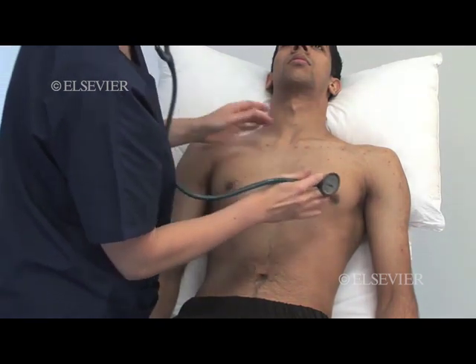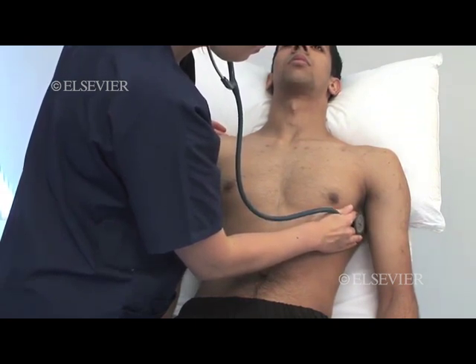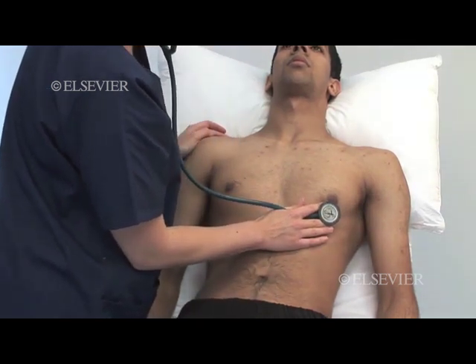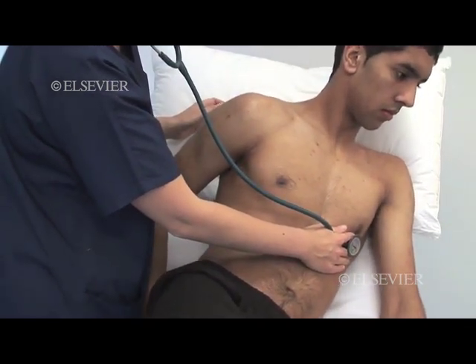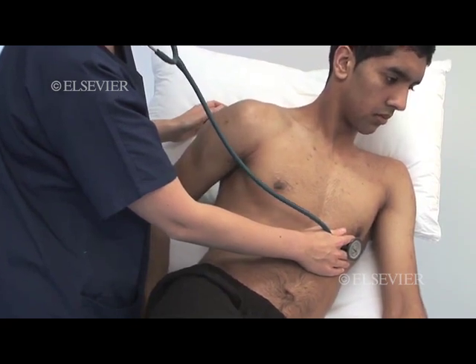Next, listen specifically for mitral stenosis with the bell at the apex. Please could you roll onto your left-hand side? This is accentuated in the left lateral position. It's a mid-diastolic rumbling sound which may follow an opening snap.